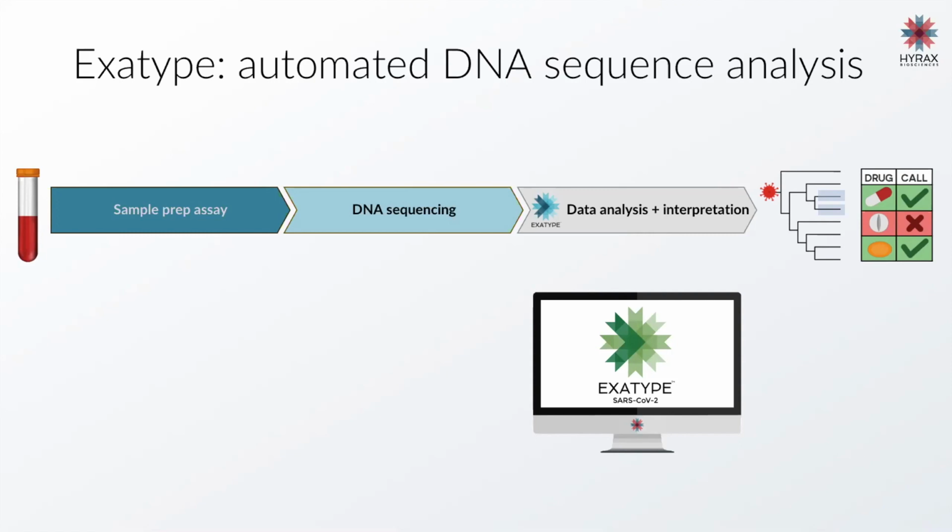And so, as you'll see later, Exatype can be deployed across a wide range of sequencing-based genetic diagnostics at scale. And for us, the ultimate goal for diagnostic software is that at scale there should be no need for end user interaction.